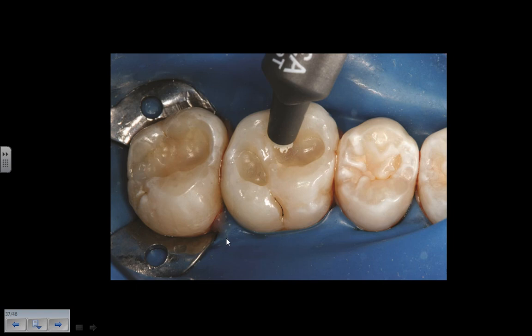We apply our composite after the adhesive's been applied, and as long as the preparations are no greater than 2.2 millimeters in thickness, we can apply it in 1 increment. Keep in mind the C factor for these occlusals is a C factor of 5. If we're at a depth of 2.5 millimeters, I'm going to place these in 2 increments to give us stress release during polymerization shrinkage.